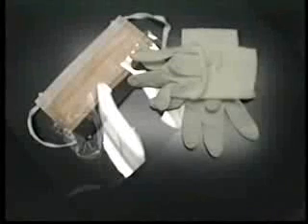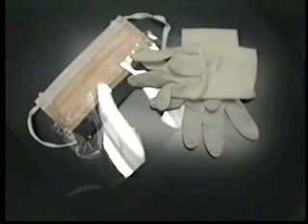You will need protective equipment as required by OSHA. Don't forget a trash can.